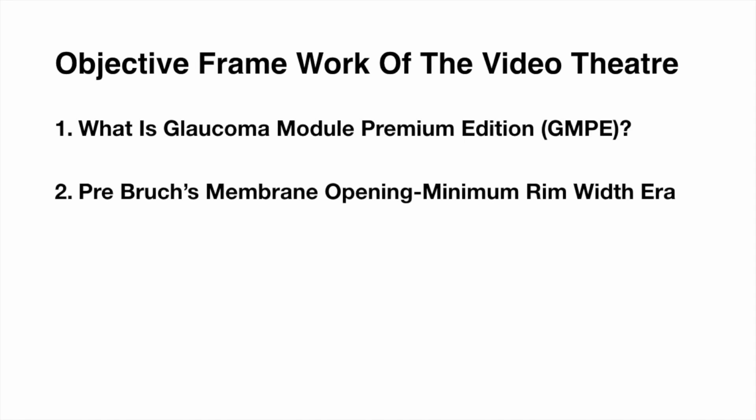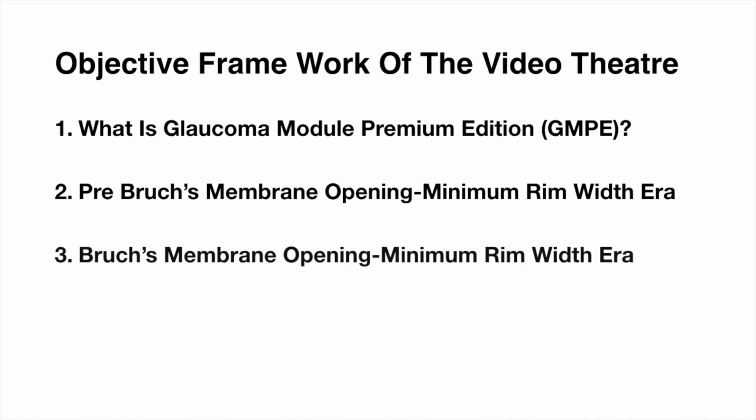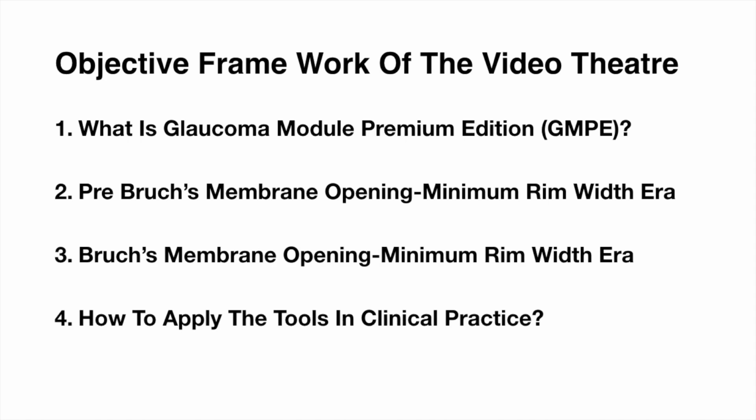Pre-Bruch's membrane opening minimum rim width era, that is the pre-BMO MRW era, versus the Bruch's membrane opening minimum rim width era, that is the BMO MRW era. Finally, how to apply the tools in clinical practice is highlighted.